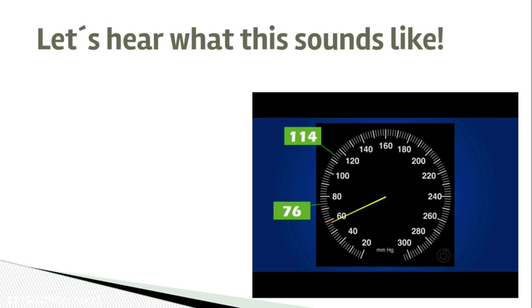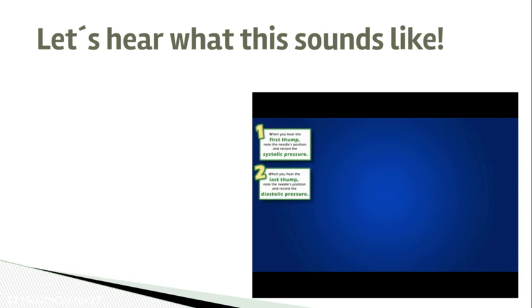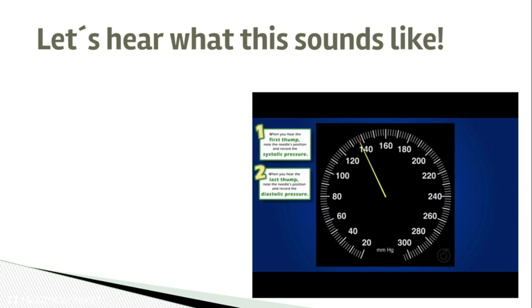Alright, now that you know the basics, let's try a few simulations. Listen closely and write down your answers. I will reveal the correct answer once the simulation ends. Here's the first one. They're not going to put the marks on there, so you see when you hear it and then when you lose it.